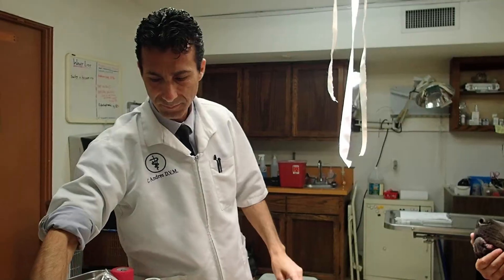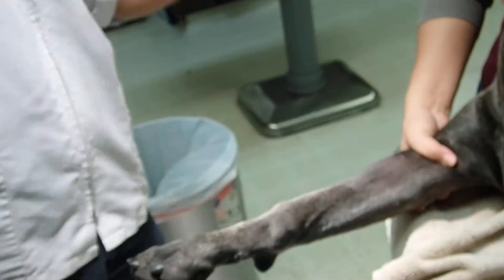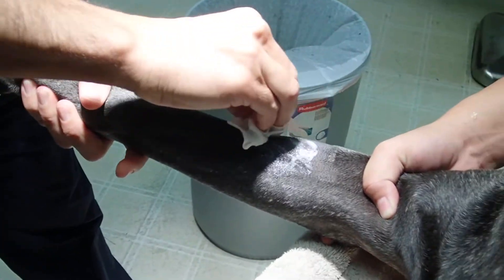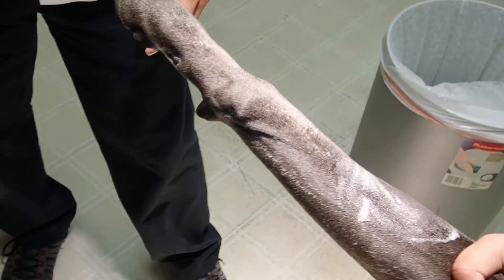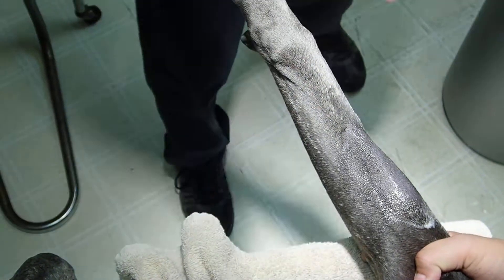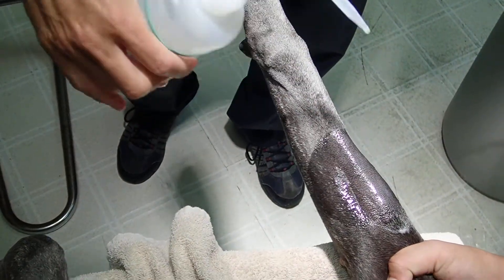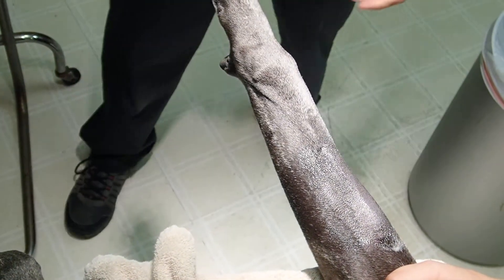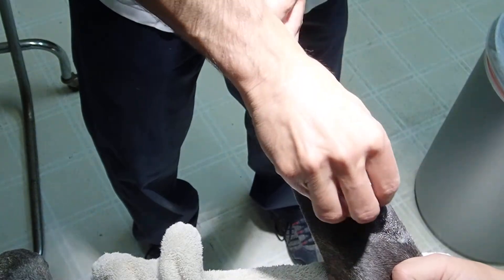So now I'm just going to prep this area — we've already clipped the area. My assistant Madison is going to hold off. We're going to start in the middle and work outward in a circle — you do not go back to the center. I'm going to follow that up with the alcohol. Sometimes if I feel there's debris or hairs, I may just soak the whole area with alcohol just to wash off some of the loose hairs. Whenever you feel like you've gotten a clean start, you can count your three scrubs and three wipes.